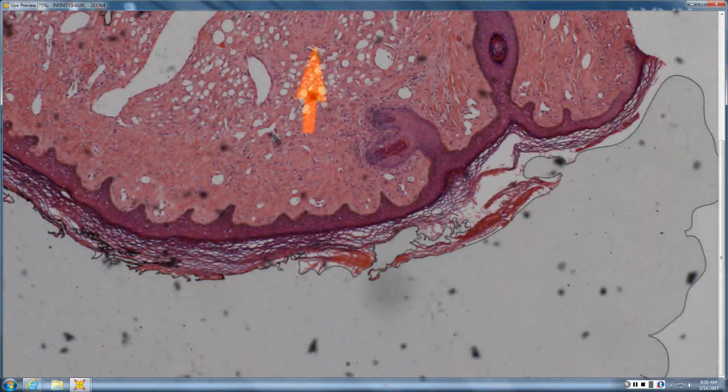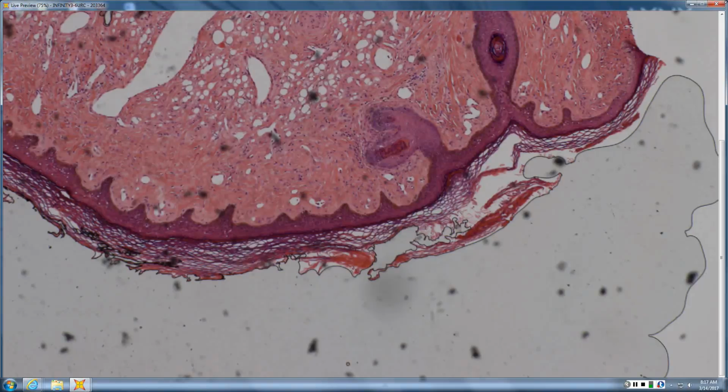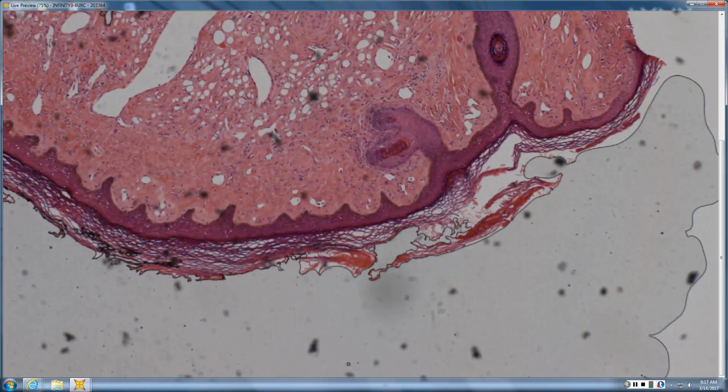So if we delete the bubbles, the air, I guess you're making kind of an onion skin motion there with the pointer. Like an onion skin motion around a follicle and around vessels. Yeah. So like parts of it look like sclerotic fibroma or angiofibroma. And I'd say maybe a little less starry night and a little more onion skin around vessels and fibrous tracts, like an angiofibroma, which is same as fibrous papule of the face.